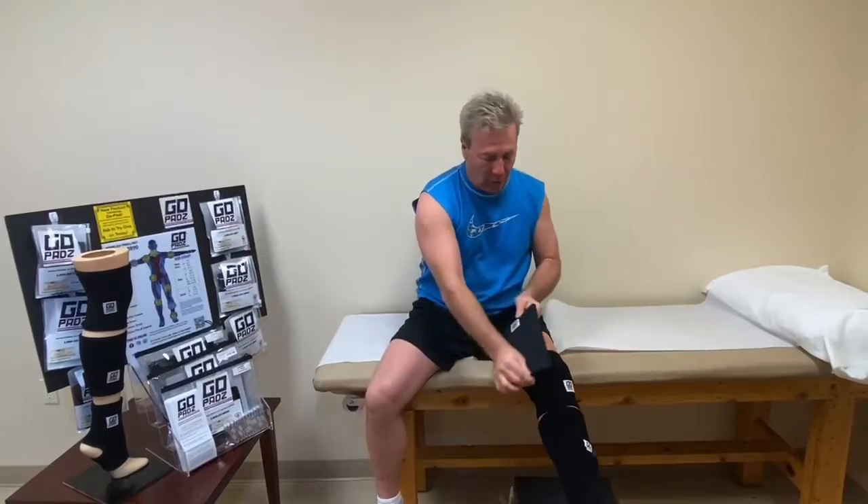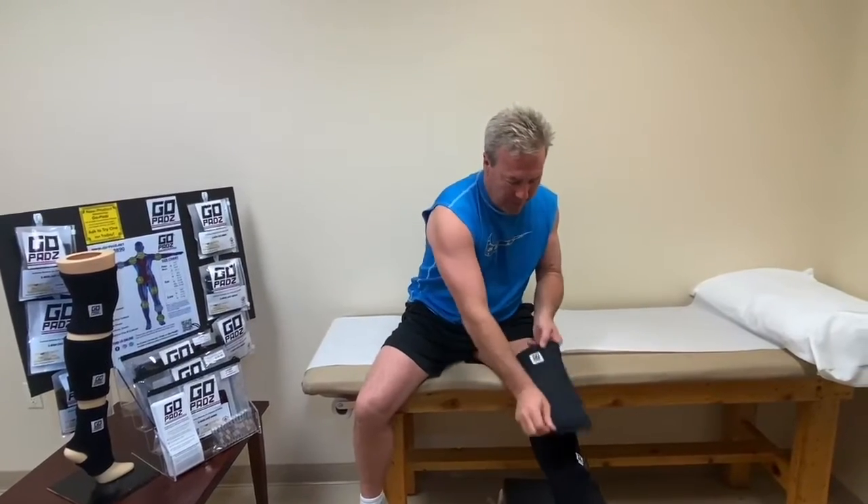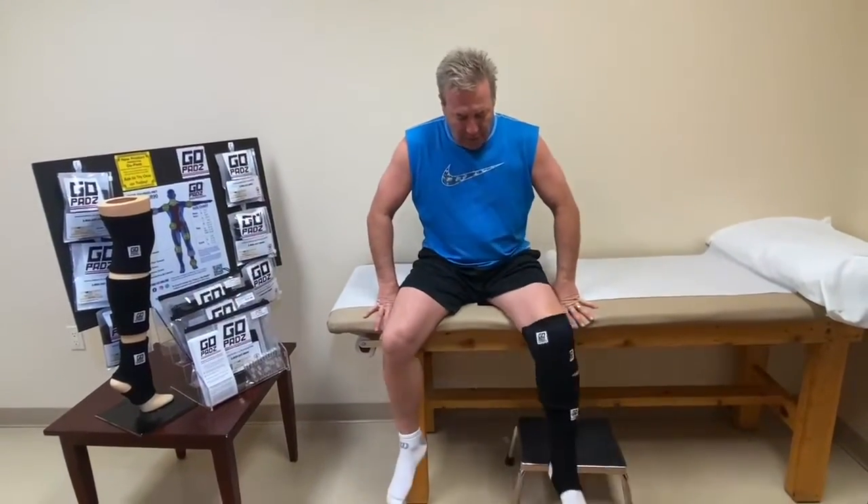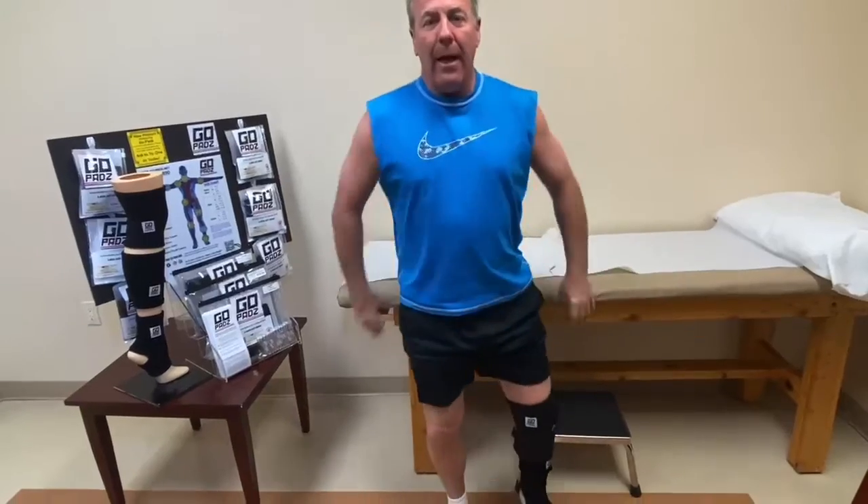When you're recovering from surgery or injury, you really want cold to reduce the inflammation. Part of the GoPads stackable compression system is the hot/cold pack — look at that, I'm going to put it right on. It sticks, no wrapping, no nothing — it stays there.